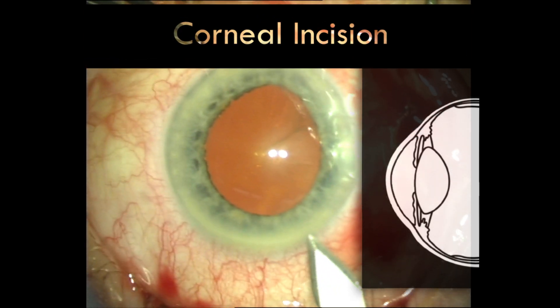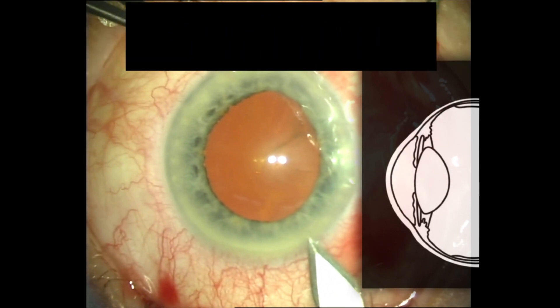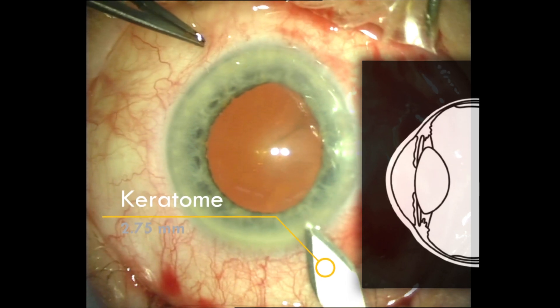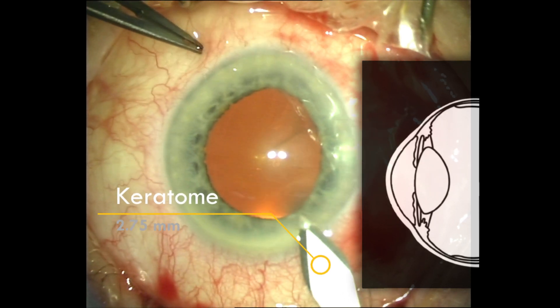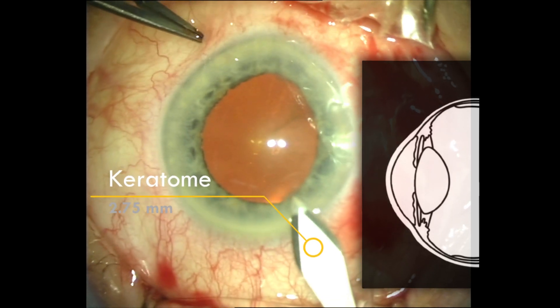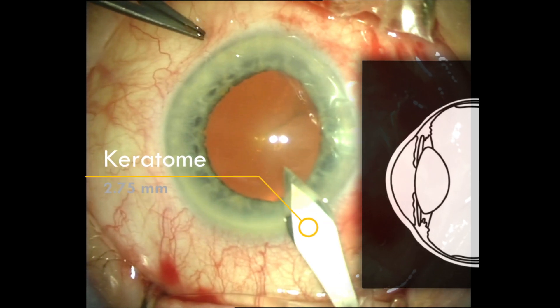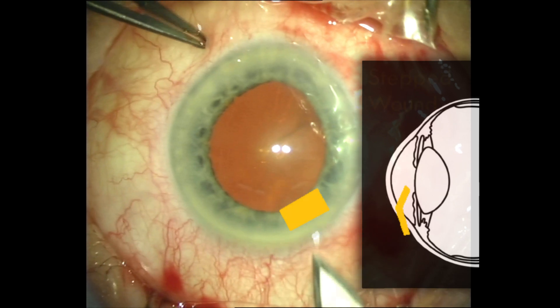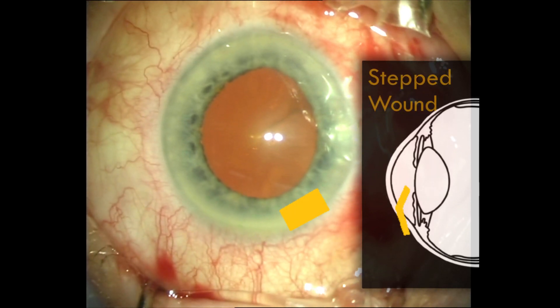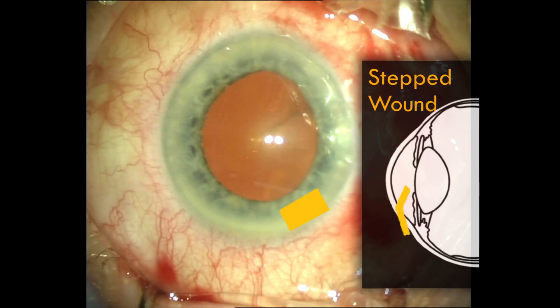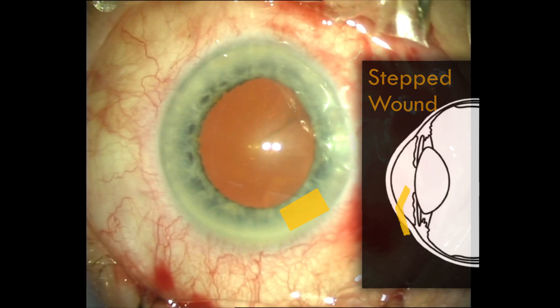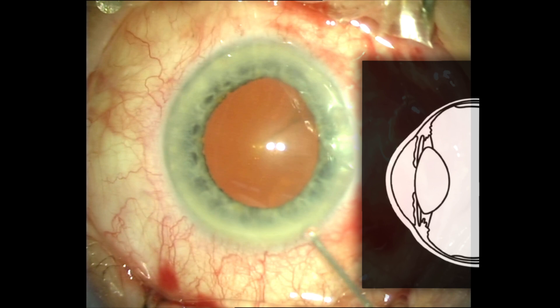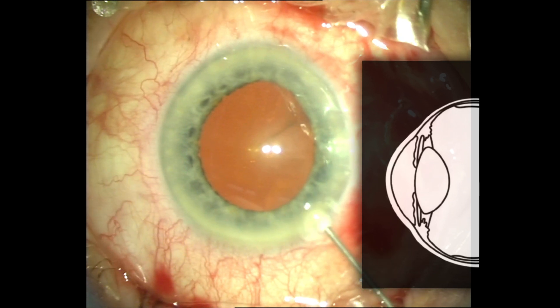The first step of the operation is to make a corneal incision. It's critical to ensure that this is a well-constructed wound. I'm using a 2.75 mm keratome and performing a stepped incision, to ensure that it's a watertight wound with no leaks.